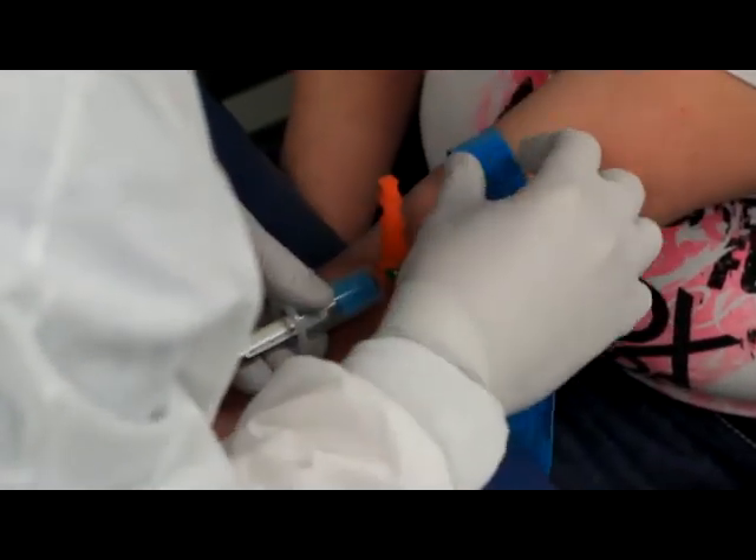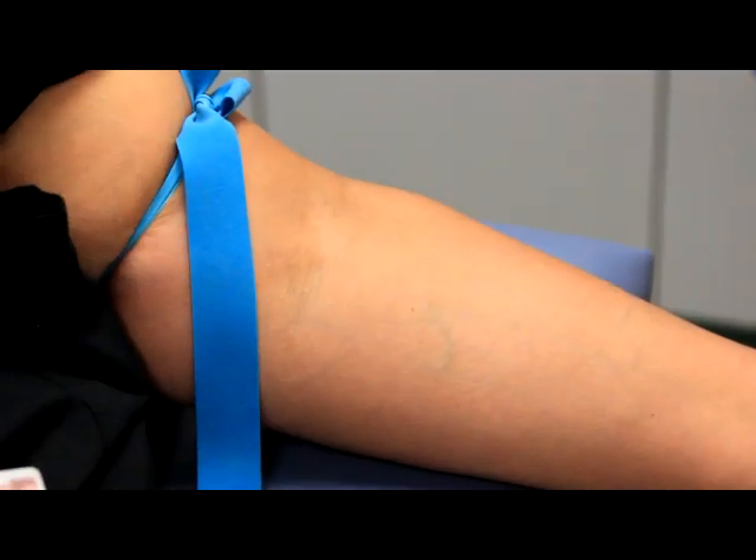Release the tourniquet by pulling the quick-release toward you, not toward the patient's shoulder.